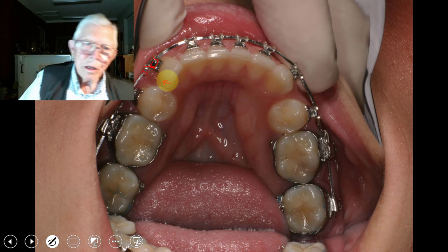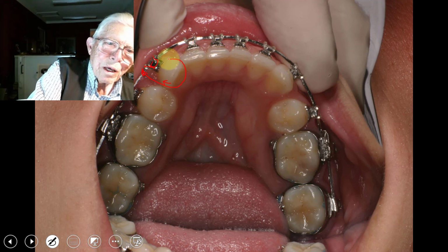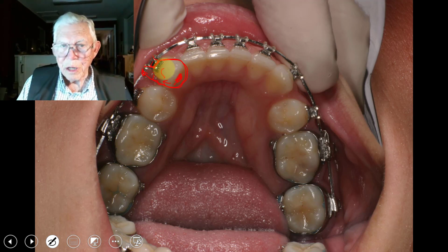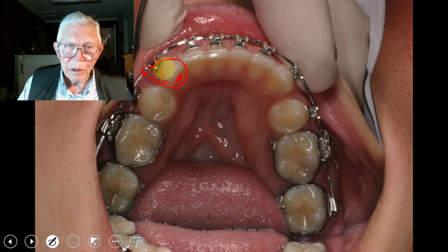You get it to do that unless you were hooking this up where you wanted to hook an elastic chain and come all around and hook the bracket right over here, but you'd have to put a lump of acrylic on it and put that chain elastic all the way around, stretch it to get it over the bracket. Now it'll turn it faster than anything, but I thought I could probably pull that in by just wiring it down and pressing it like that.